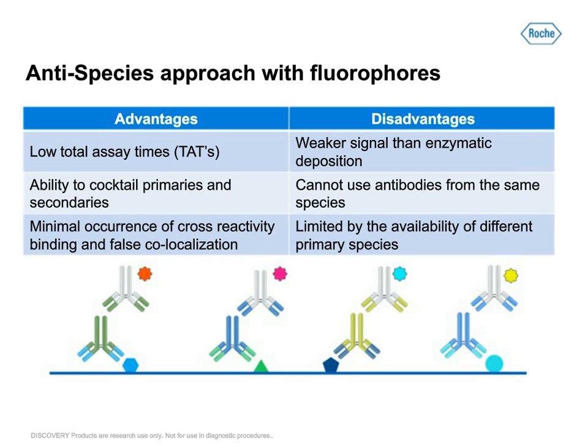If your signal is too weak, I did mention you can use enzymatic deposition with tyramide fluors. And typically this is done with HRP. So if you have your optimal DAB assay ready to go, it's real simple plug and play, where you just remove DAB from the equation and you just come in with your tyramide fluor, and you already have your optimal IF assay.